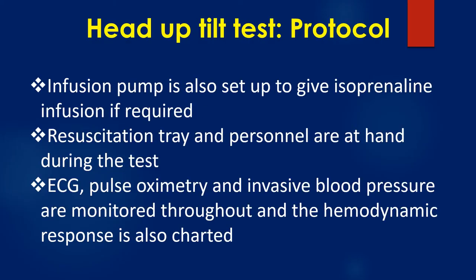Infusion pump is also set up to give isoprenalin infusion if required. Resuscitation tray and personnel are at hand during the test. ECG, pulse oximetry and invasive blood pressure are monitored throughout, and the hemodynamic response is also charted.